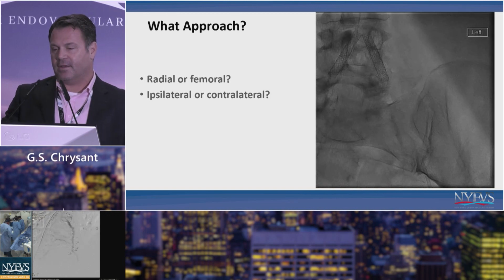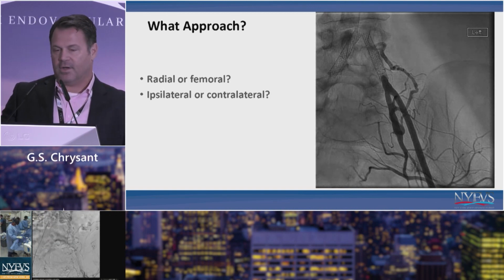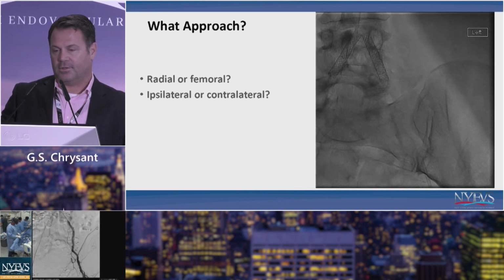And here's something that I think a lot of us see. It's a little more standard. So I think most of us would probably go for it from a femoral approach, but you certainly could try to come down and cross from radial.